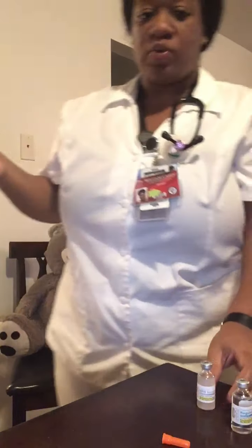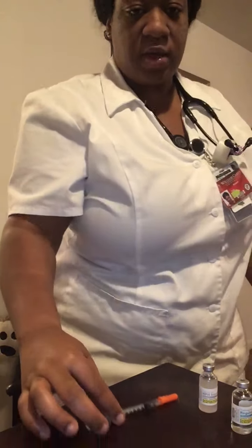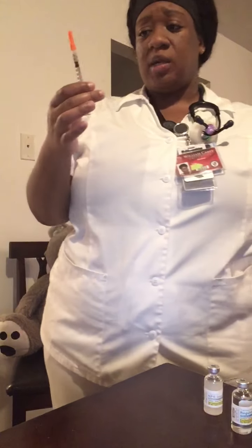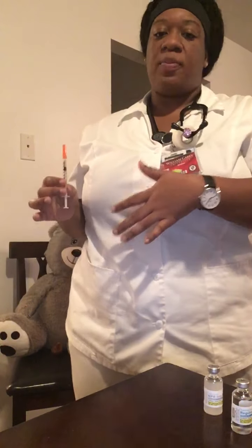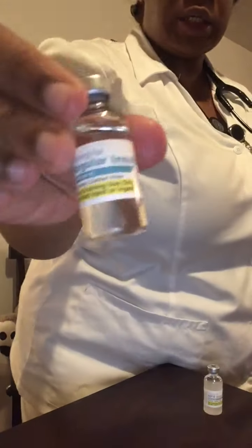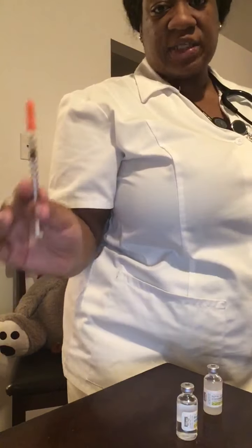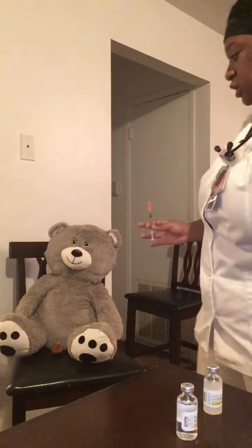So now I'm going to safely recap the needle. I'm going to pull it back here so you can see. We're going to safely recap the needle. Needle is recapped. If I was not in the patient's room, I would label the syringe, but being that I am in a patient room, I do not need to. So we're going to do another check here. We have regular insulin, 6 units, and we have NPH, 16 units. I have asked the second nurse to verify this. The nurse has verified. So then I'm going to turn to my patient.